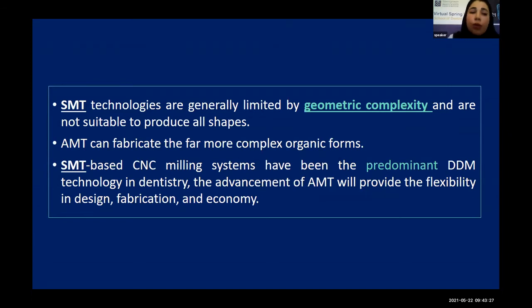It's very important to know that subtractive manufacturing technology is generally limited by geometric complexity. And additive manufacturing technology can be used in fabrication of more complex organic forms. But in dentistry, the predominant technology is SMT.